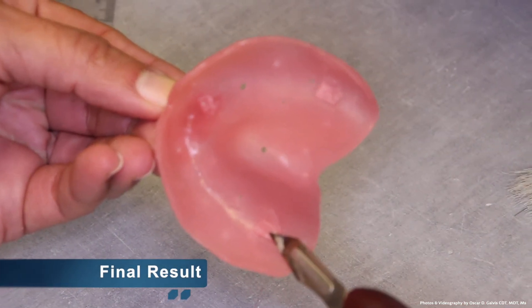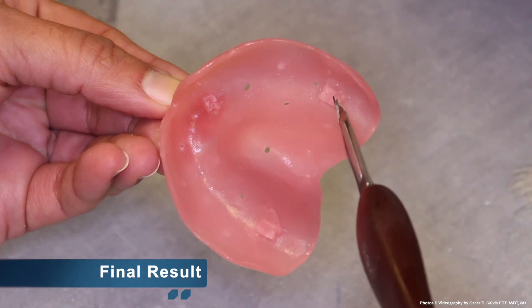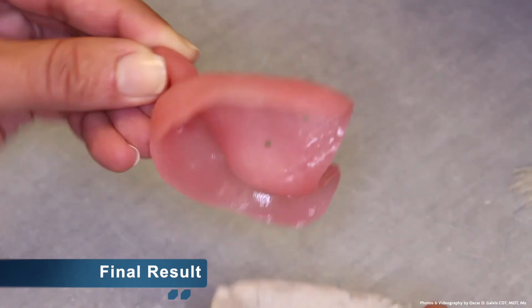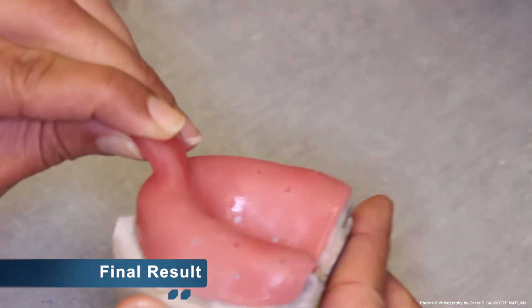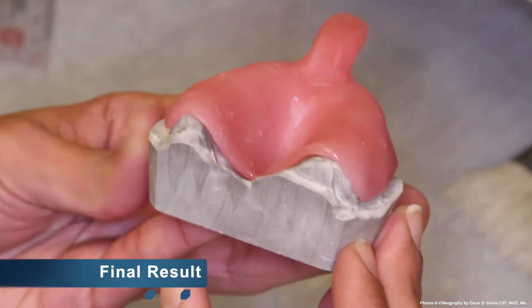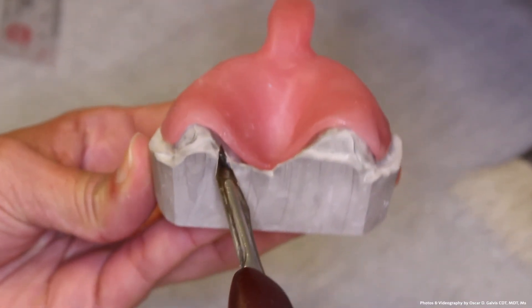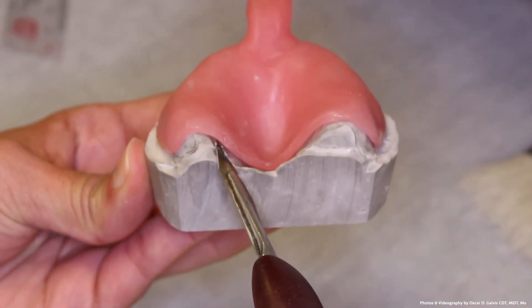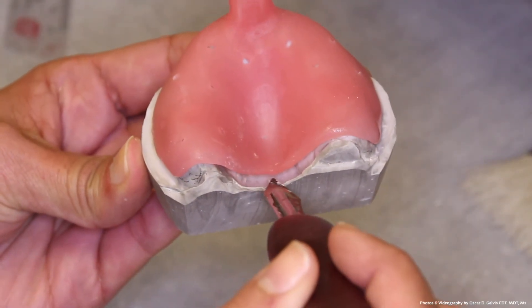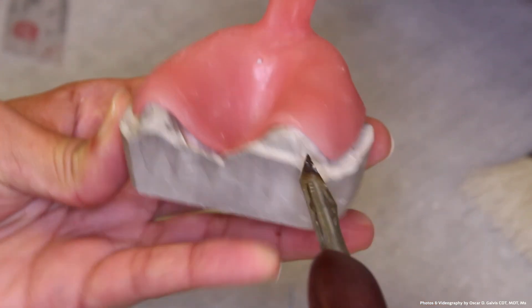Your final results should show your tissue stops within the intaglio surface of your custom tray, your retention holes, and your borders should be smooth, and the tray should be passive. You can clearly see a one millimeter even space throughout the custom tray. This is what the spacer and the tissue stops provide: a uniform space for uniform impression thickness.